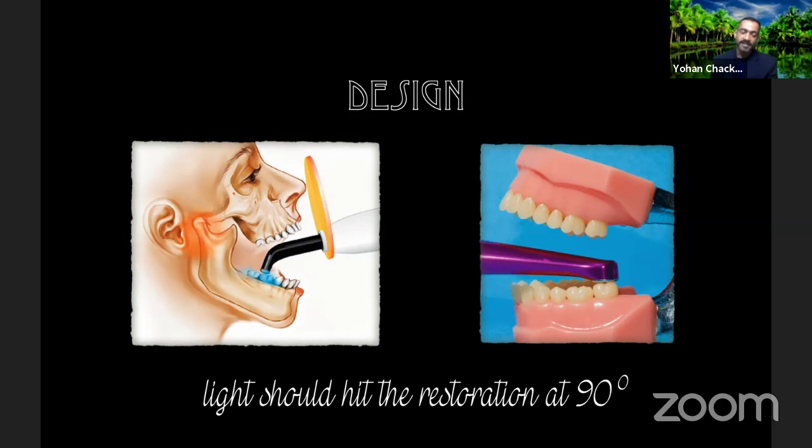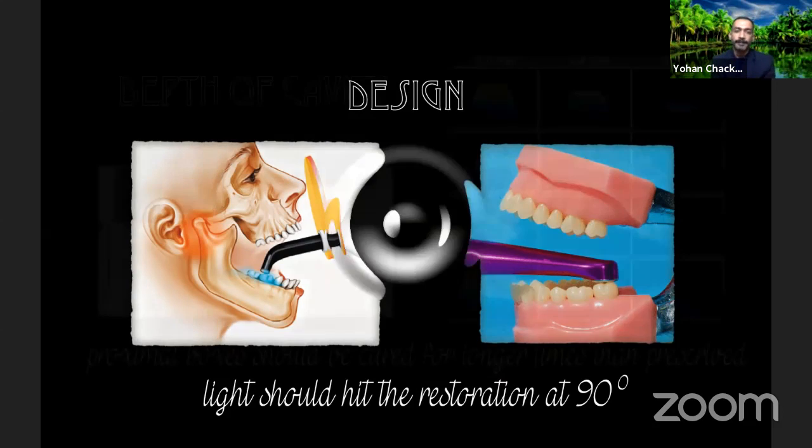So with a curved tip design, the patient's jaw has to open almost like a python, really wide, in order to get that 90 degree inclined light falling on the restoration. If the light falls at an angle, again, you're losing out on the energy potential of your light. The total energy of your light is going to drop, and therefore you will have to start curing for much longer times if you don't achieve this 90 degree placement of your curing light head.